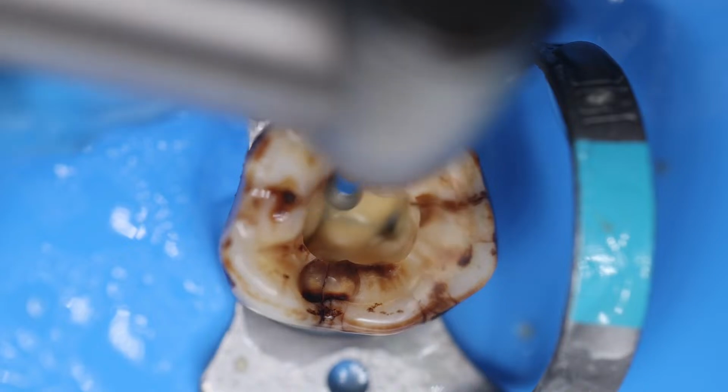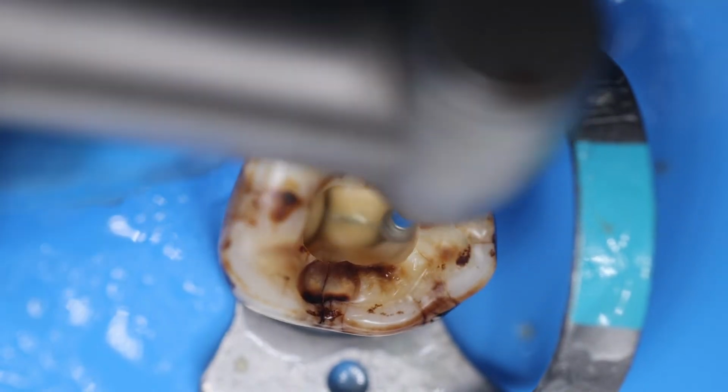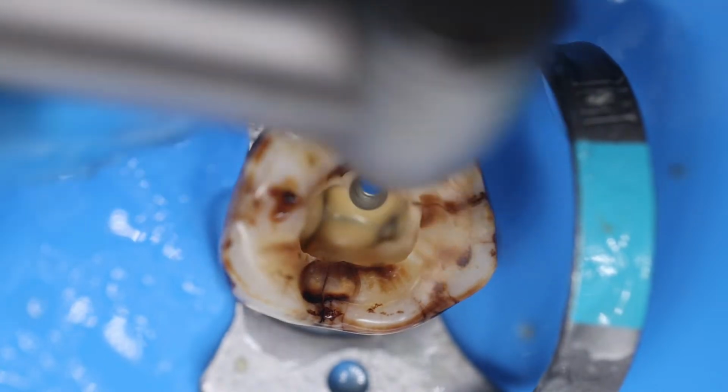You can just follow the outline of the tooth to form the access cavity shape, if you have the sound tooth, in that case only.